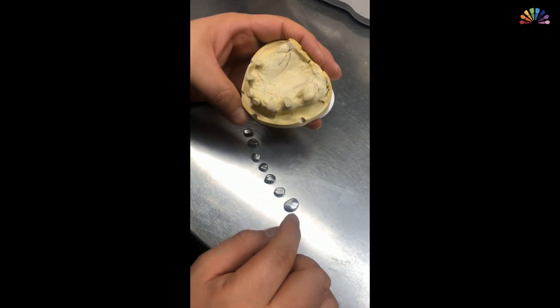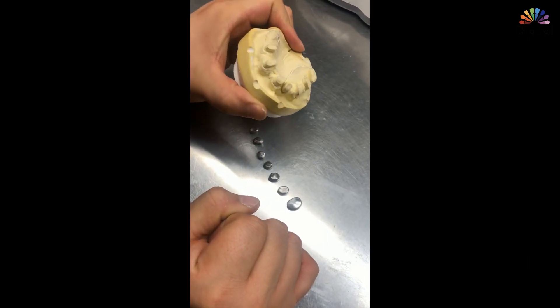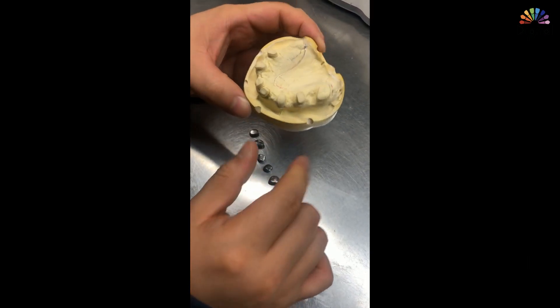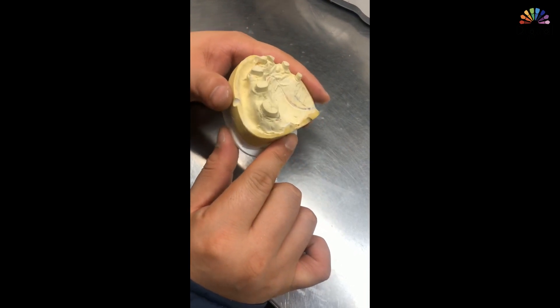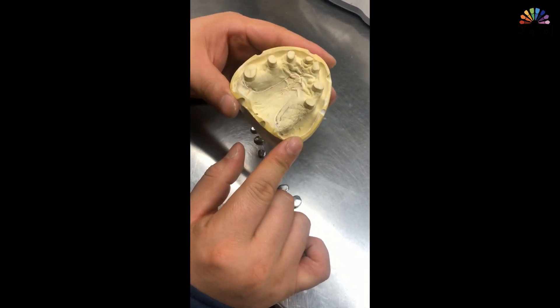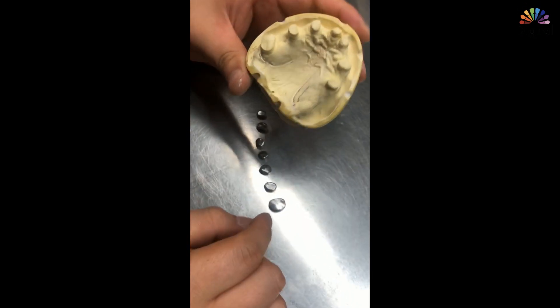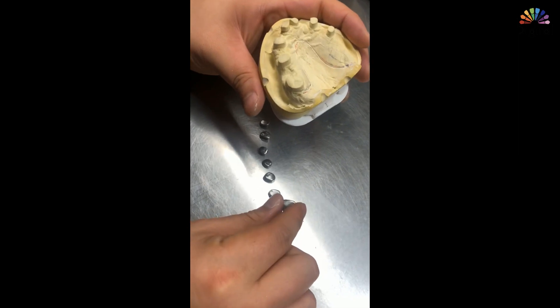Here I have titanium copings which go on the first telescope copings. I first designed the telescope using 3Shape software, then milled it all with cobalt chrome. The doctor already delivered and cemented them, and here I have the secondary copings.